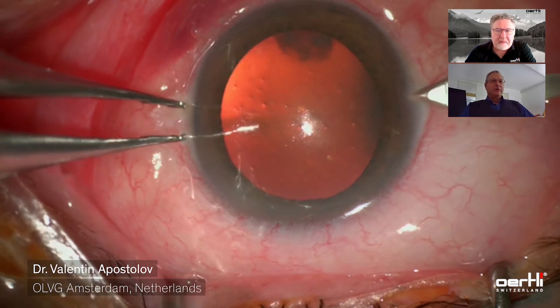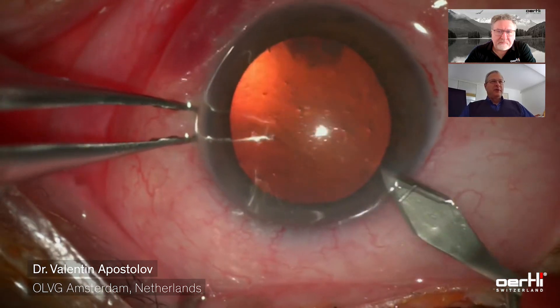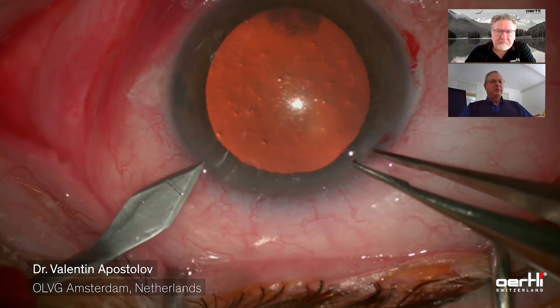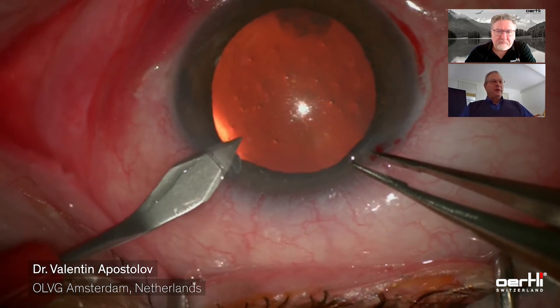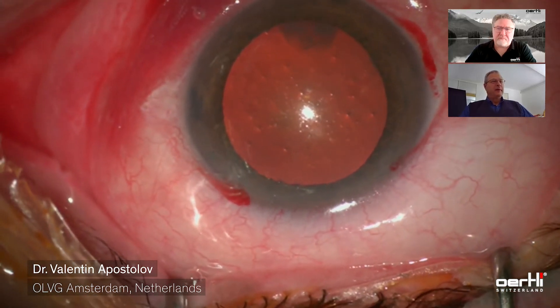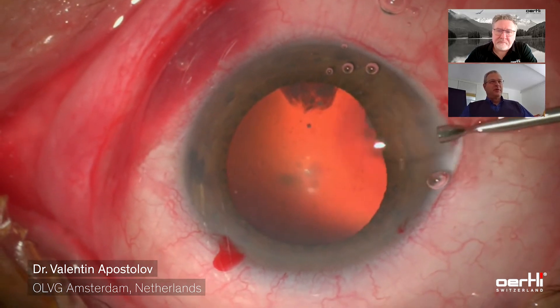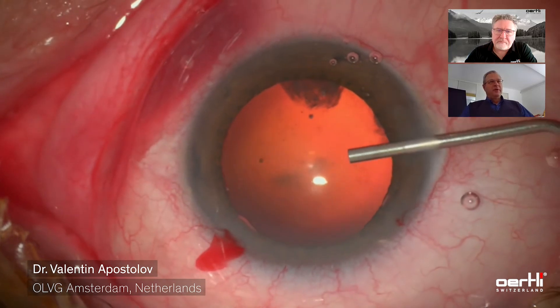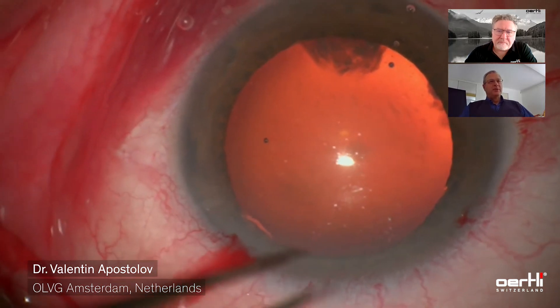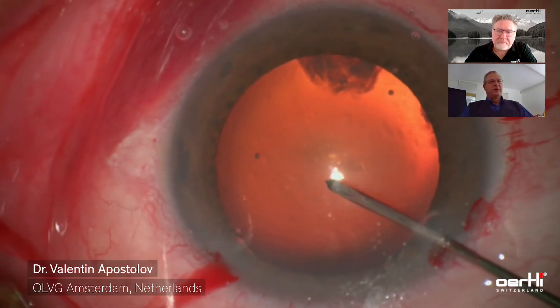We are going to see a routine cataract surgery. I prefer corneal incisions and I prefer to place the main incision temporarily because it has less influence on astigmatism and also gives a more stable wound. I like to make two side ports because I'm using the bimanual IA. Dispersive OVD is applied on the cornea, filling the anterior chamber. I do that with dispersive OVD because I'm mostly doing the capsulorexis through the side port, so there is no egress, no leakage of OVD, and the anterior chamber stays full all the time.